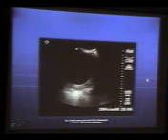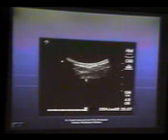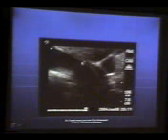This is a hydatid cyst, unilocular looking, quite large. When I enlarge the picture, zooming in, you can appreciate the double wall here. In this view, it looks like a simple cyst. But as you go on to have a closer look, you will see that it has got a double wall, one of the host reaction, one of the cyst. The double wall sign can be appreciated at certain angles and with enlargement.